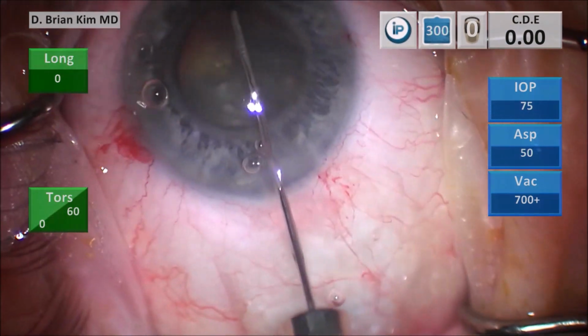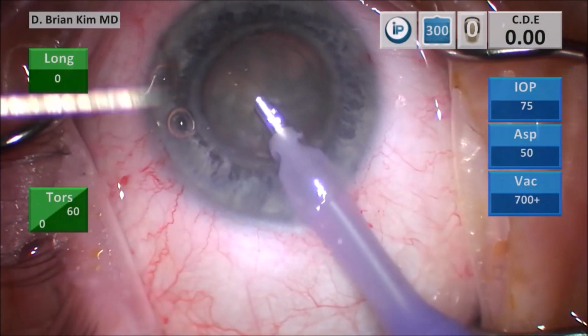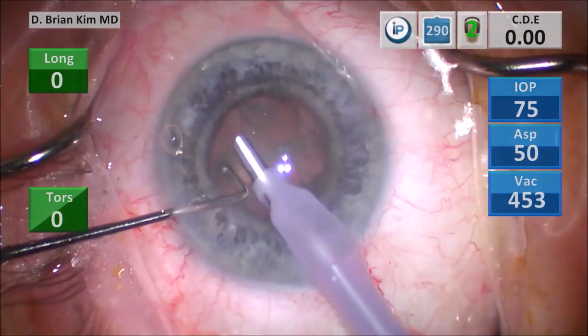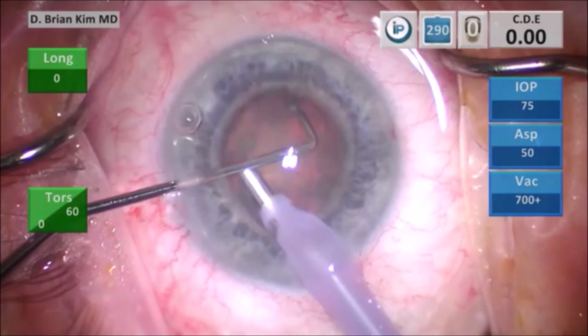I start with my phaco, but before doing that, I lift the incision with the chopper and go in with irrigation off to minimize Descemet's trauma. Once I get in completely, I start removing the surface epinuclear material. I do my double chop technique. I place the chopper out to the equator, making sure I'm underneath the epinuclear material. That is my landmark. That is the shelf that I'm going to use.